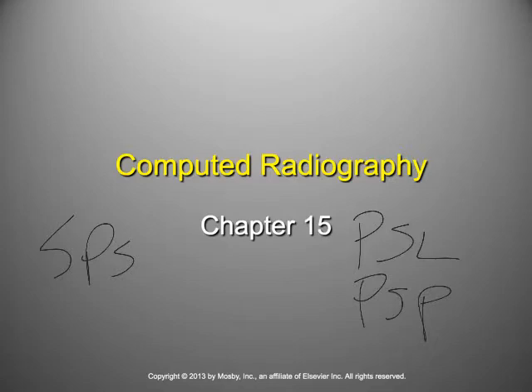And a significant thing about this SPS is it's the part that we really can see. It appears white. So when we open up a CR image receptor plate, we see this white screen. It reflects because it scatters light off of it, and that property of scattering light we're going to call turbid or turbidity. It means that there's a limit within the screen in that as it's sensing the X-rays, it's simultaneously scattering light. So we have to figure out ways to account for that.